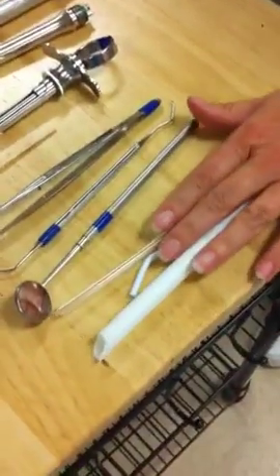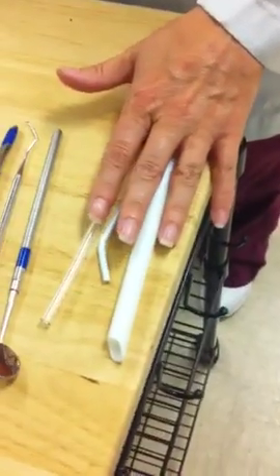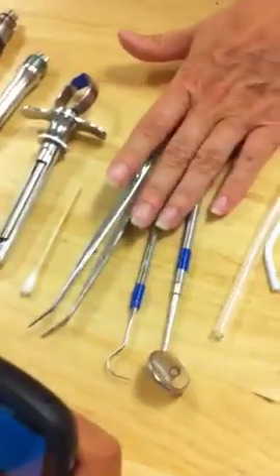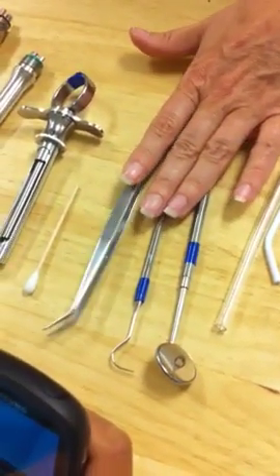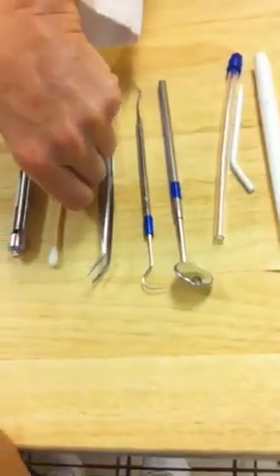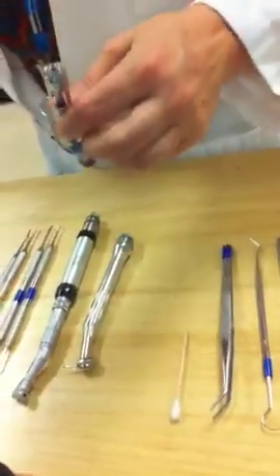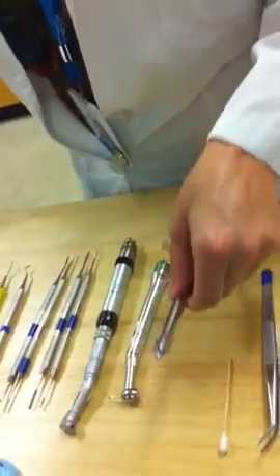So you're going to have your basic disposables, your HVE, your air water syringe, and your saliva ejector. Your basic instruments are the mouth mirror, the explorer, and the cotton pliers. You'll be putting the x-rays of the patient on the x-ray viewer for the doctor. You'll be using the cotton swab to place topical anesthetic on the area. And then the doctor will be using local anesthetic to get the patient numb.